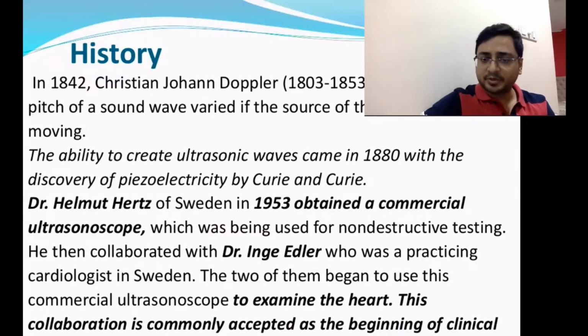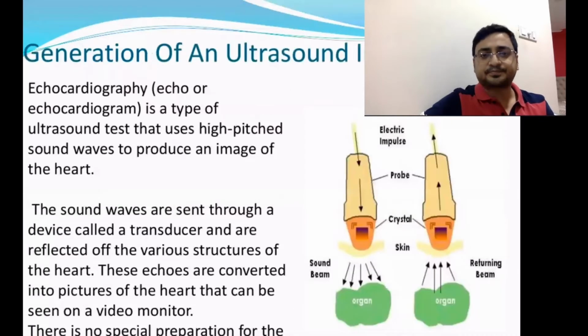He then collaborated with Dr. Edler, who was practicing as a cardiologist in Sweden. The two of them began to use this commercial ultrasonoscope to examine the heart. And this collaboration is commonly accepted as the beginning of clinical echocardiography as we know it today.